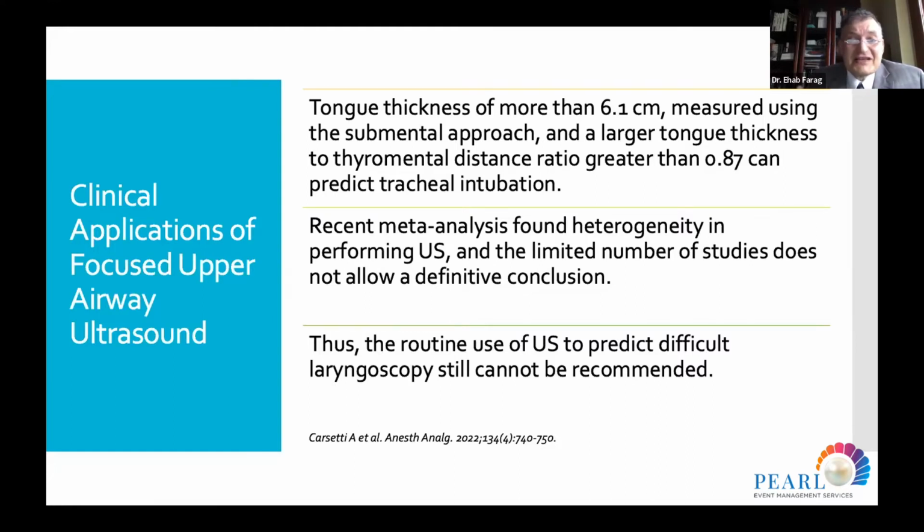However, a recent meta-analysis, just published in Anesthesia and Analgesia this year, a couple of months ago, found that the heterogeneity in performing ultrasound and the limited number of studies does not allow a definitive conclusion. Thus, the routine use of ultrasound to predict difficult laryngoscopy still cannot be recommended. However, my understanding and my recommendation is, if you have the ultrasound and you have a patient, you can have an assumption in your mind when you are doing this measurement that this patient might be a difficult intubation, and prepare for yourself.